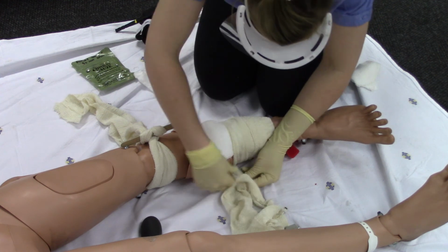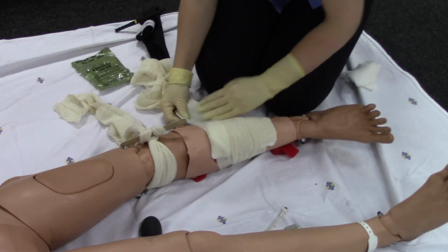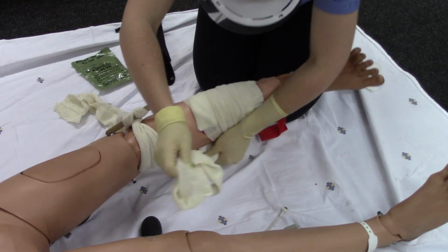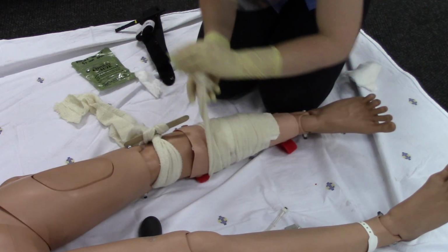On the note of the tourniquet, never use a wire, rope, belt, or any other narrow material as a tourniquet. This could cut into the skin. Also, never cover a tourniquet with a bandage. The tourniquet must be left open in full view.